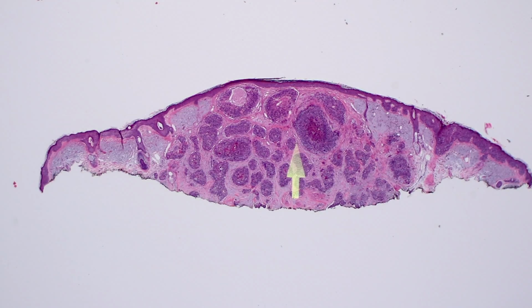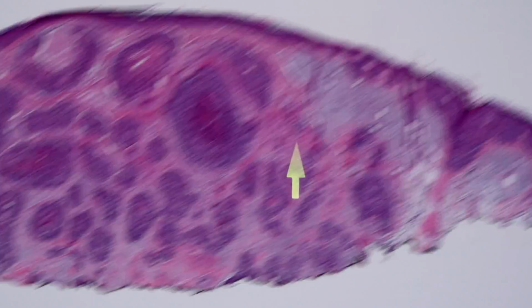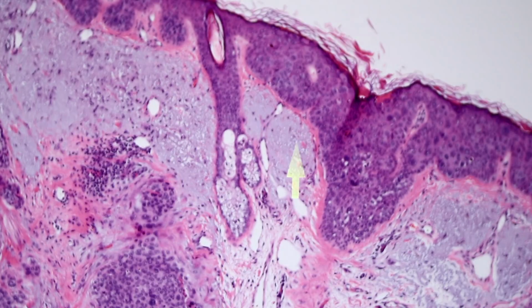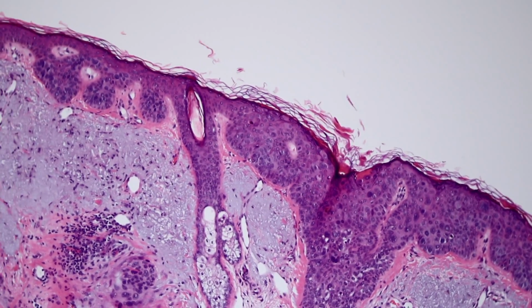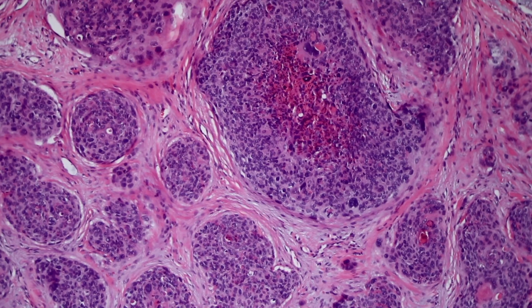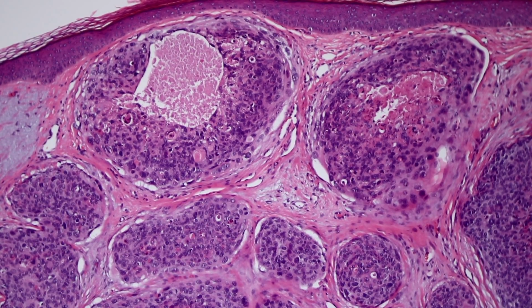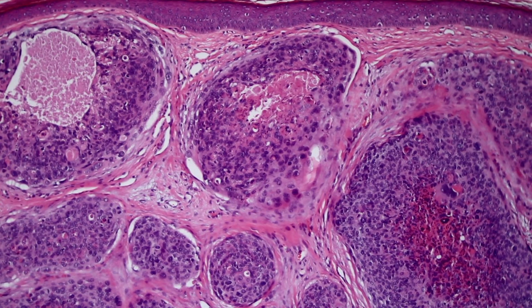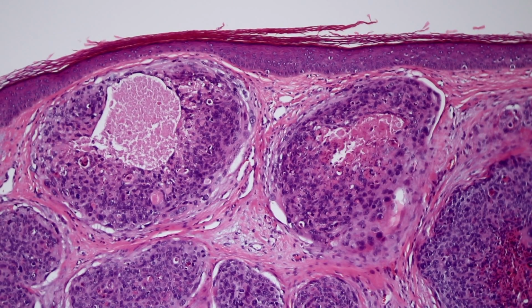All right, so if we look elsewhere on this slide, here's what we're going to see. We had in situ here, and now we've got invasive squamous cell carcinoma. Here's the squamous cell carcinoma in situ, full thickness atypia, and then as we come over here, you can see that it invades down into the dermis. And it's got some necrosis in the center of these nests, and also dying keratinocytes that leave these blobs of pink keratin there, which help us decide that it's actually a squamous cell carcinoma when it's producing a lot of keratin. That's not always true. Sometimes basal cells and other things can produce keratin too.